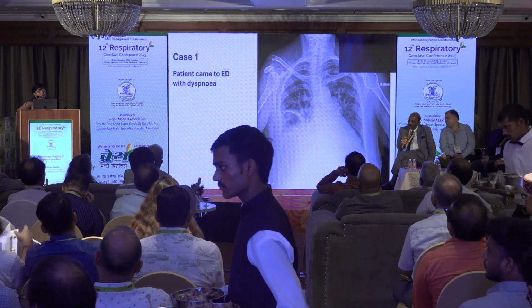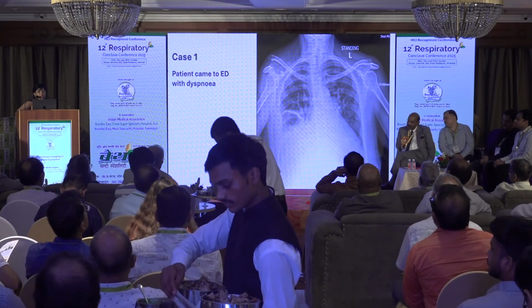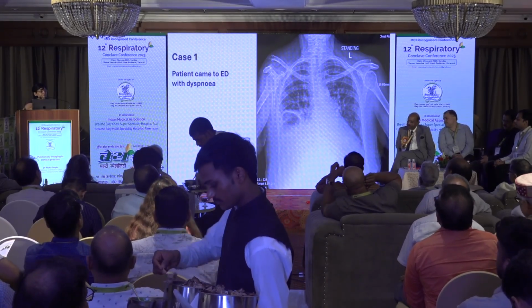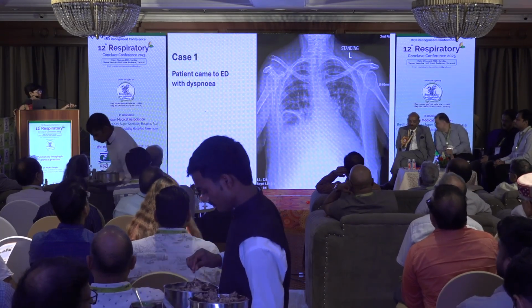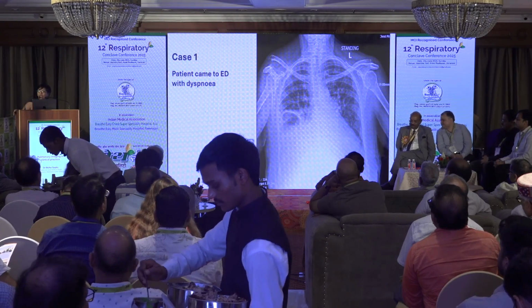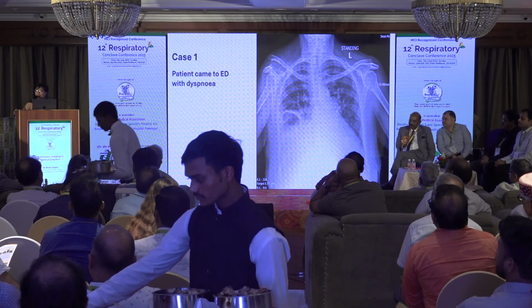Let's look at case 1. The patient came to the emergency department with dyspnea. I want some of the people to actually respond, otherwise it becomes very monotonous. What do you see in this X-ray? Of course, the pathology is on the right side. Anybody want to volunteer? We don't have much time, so quickly if we can do. Yes, Swapnil?